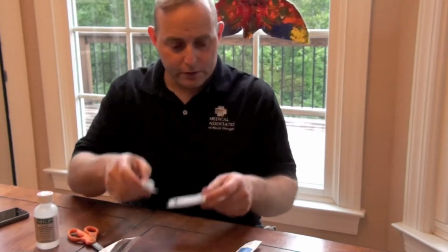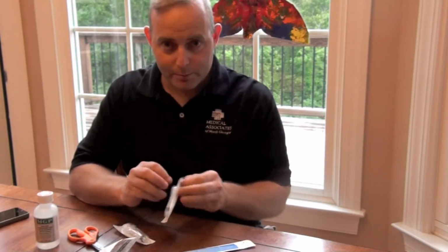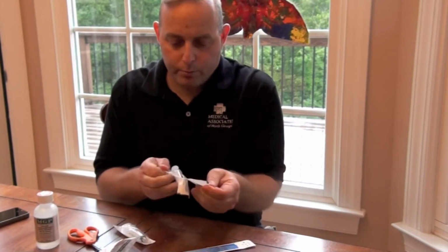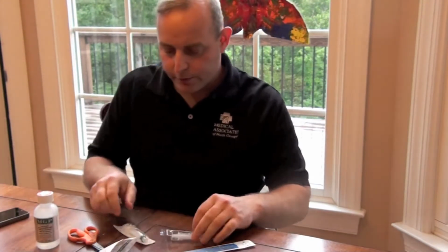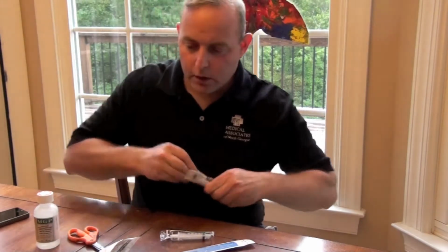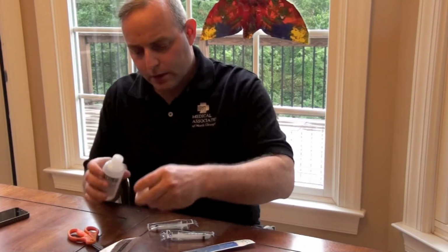I'll use 2 5cc syringes and sterile cotton-tipped applicators, not Q-tips. A Q-tip is not long enough to reach the posterior nasopharynx. The first thing to do is get the patient pre-anesthetized.